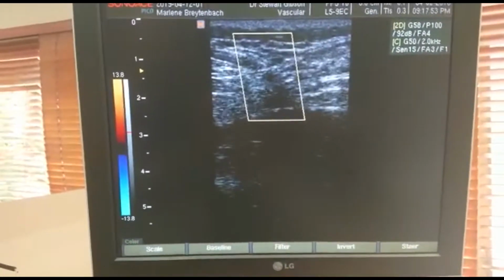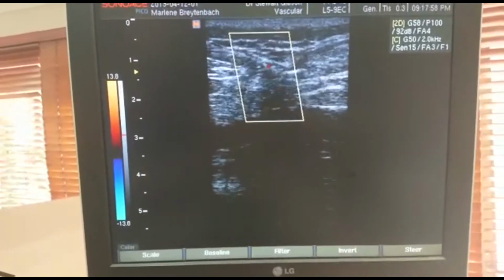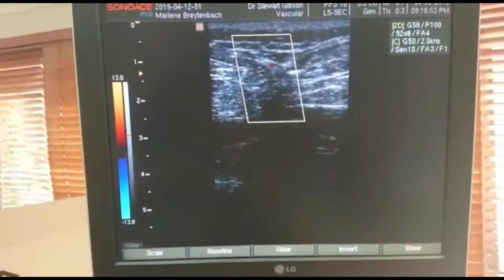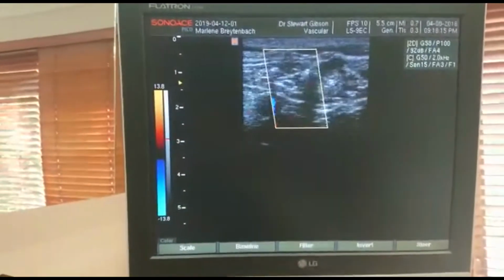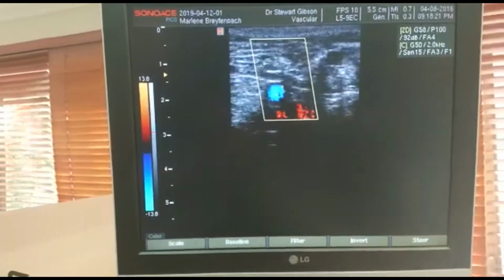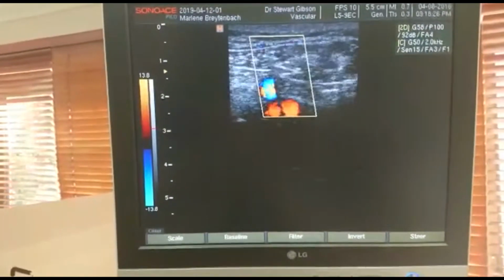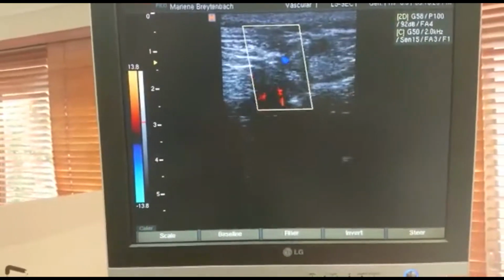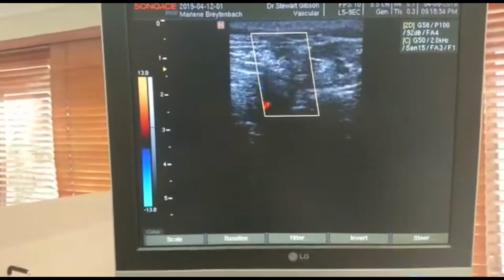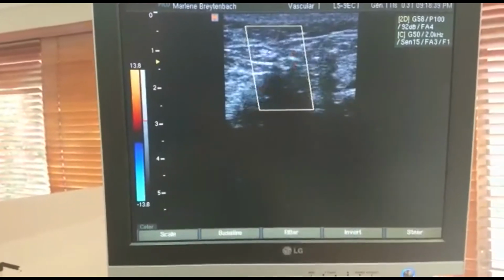So we stayed away from the proximity of the major superficial femoral artery and the deep venous return, and we were able to effect closure of the high flow vein and demonstrate that the artery is still fully functional, the deep circulation is fully functional, but the superficial, that epigastric branch, shows evidence of some foam in it, but it is essentially closed. Success.